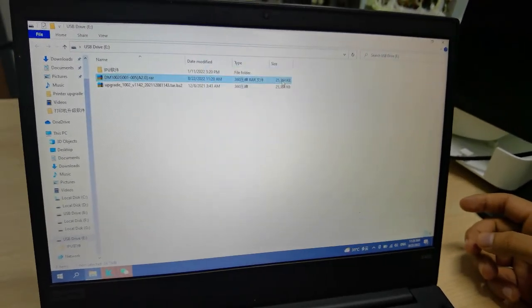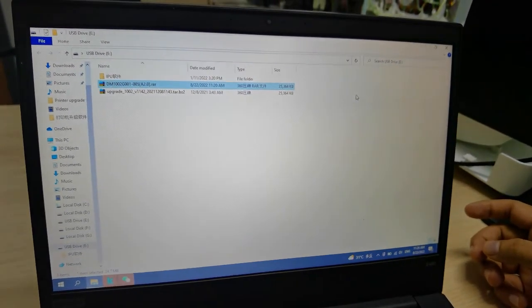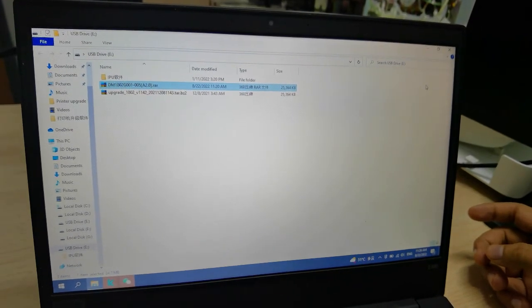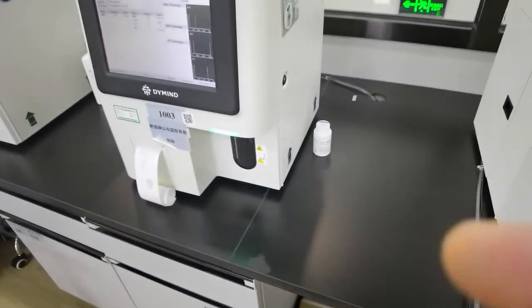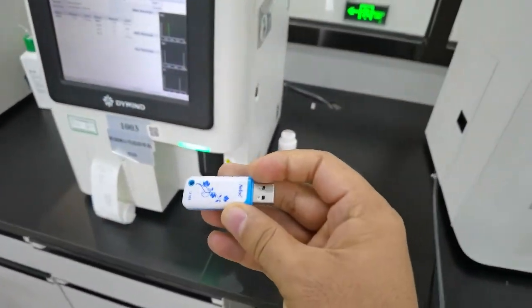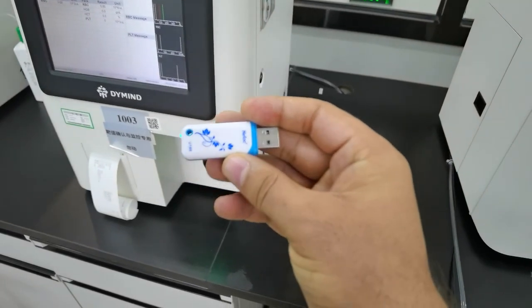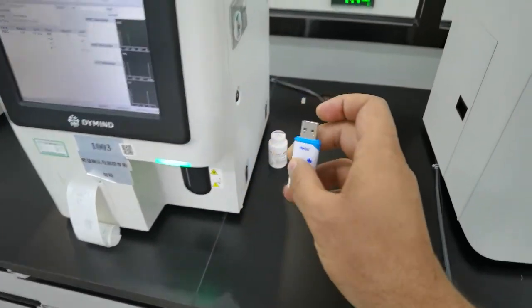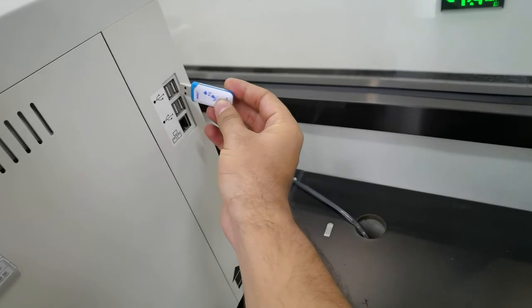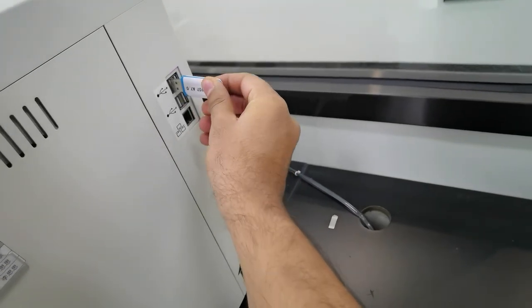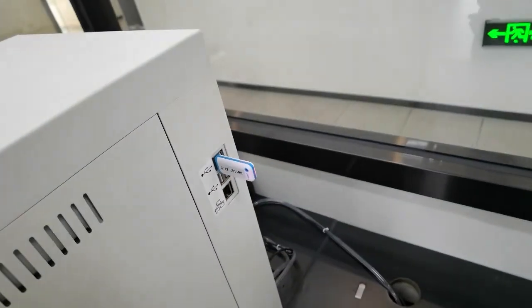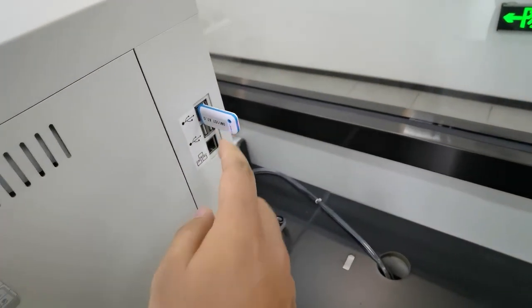As you know, the software is already inside the flash drive, already unzipped. Now I connect it with the analyzer. Connected. You can see the light flashing properly, connected.